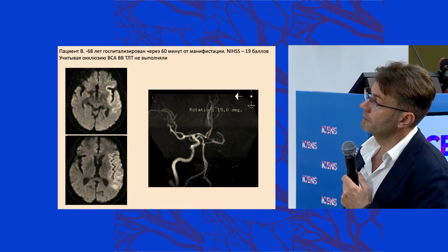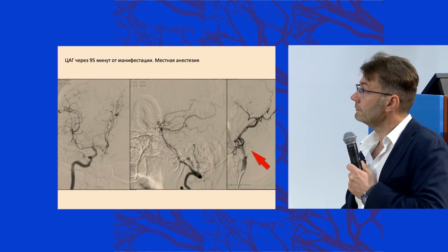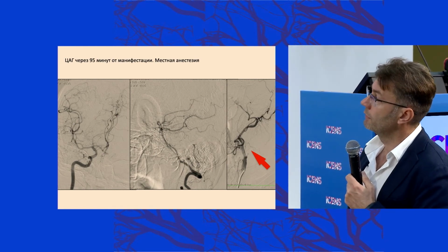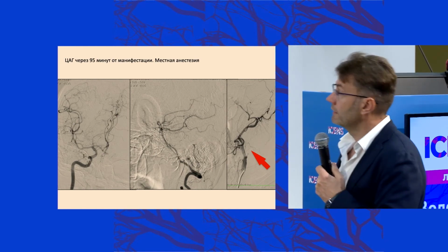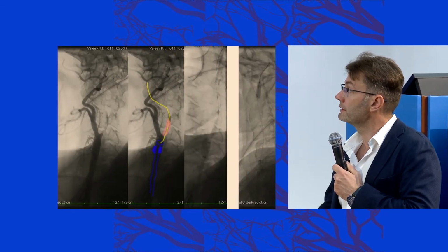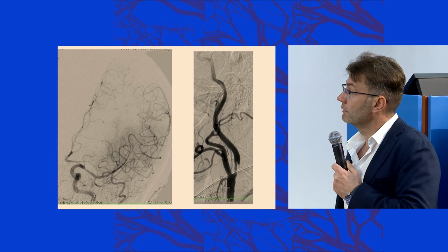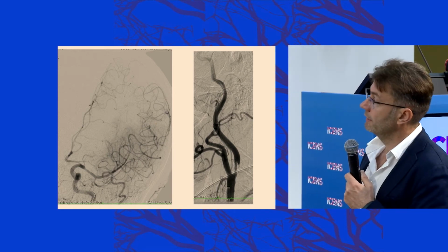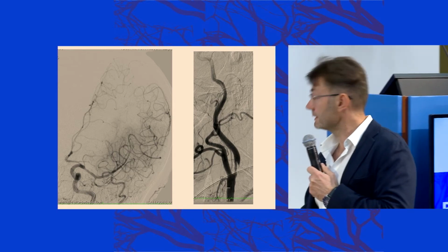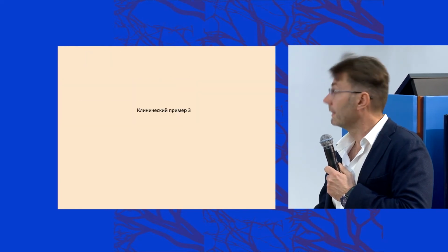No ischemia on visualization, but you see here, DWI shows the signs of developing ischemia. ICA occlusion, panangiography, the circle of Willis is not closed, occlusions of the intracranial regions of ICA, two-balloon technique, revascularization. The blood flow intracranially is restored, and after restoration, we perform the carotid angiography. We see a plaque that we cannot leave. Stenting is necessary. We did it.